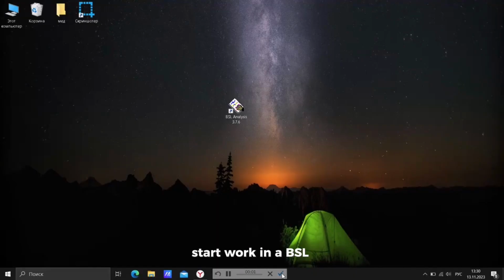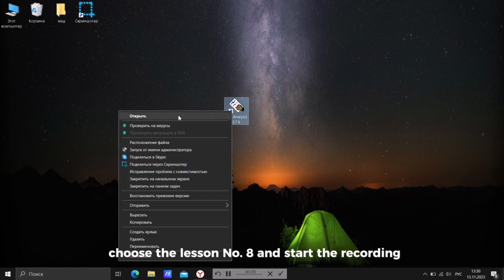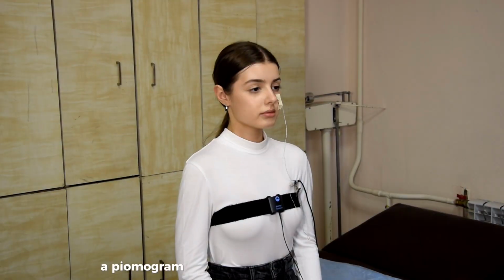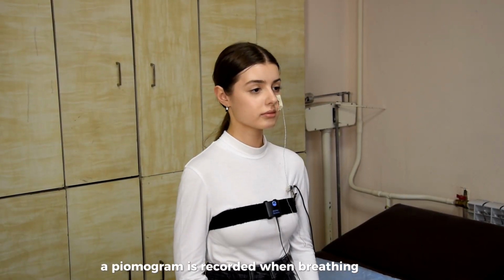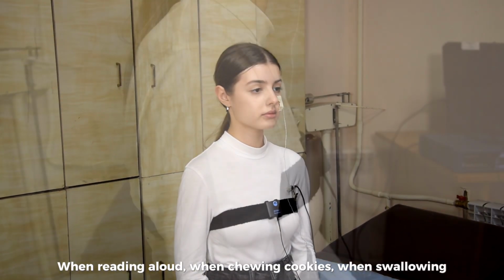Start work in the Biopac Student Lab. Choose lesson number 8 and start the recording. A pneumogram is recorded when breathing calmly, when reading aloud, when chewing cookies, when swallowing.